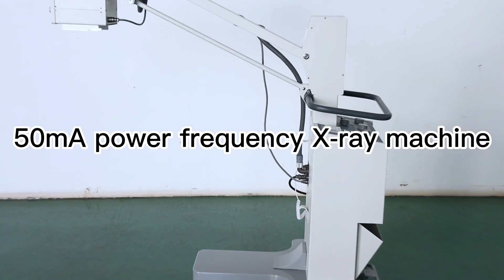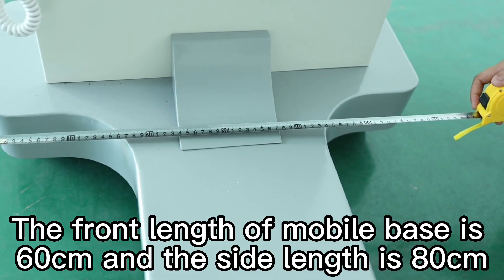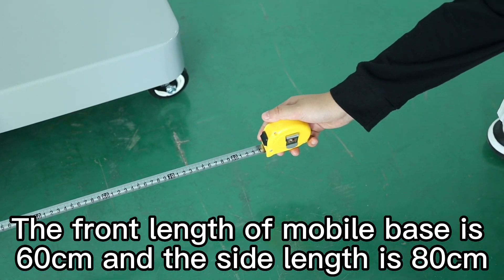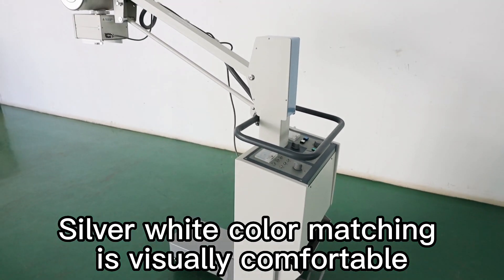50mA Power Frequency X-ray Machine. The front length of the mobile base is 60 cm and the side length is 80 cm. The silver-white color matching is visually comfortable.